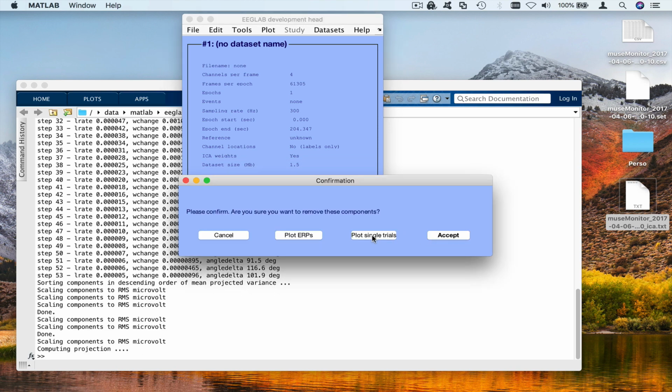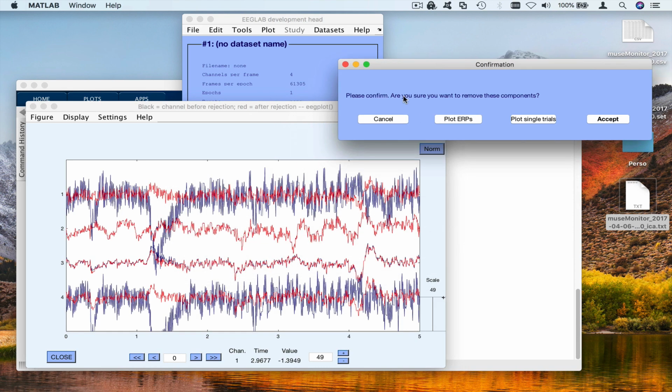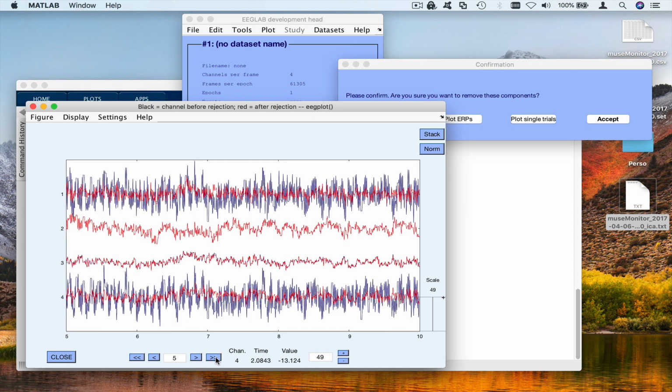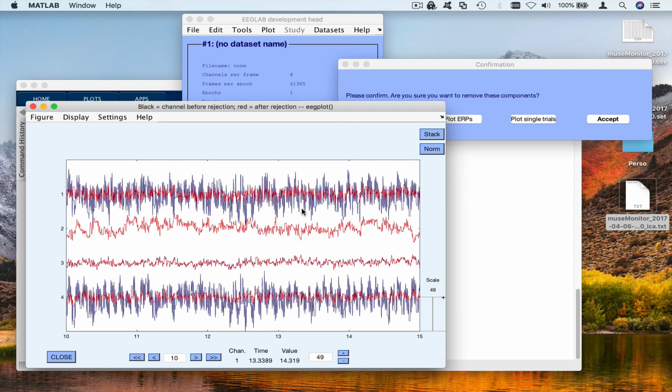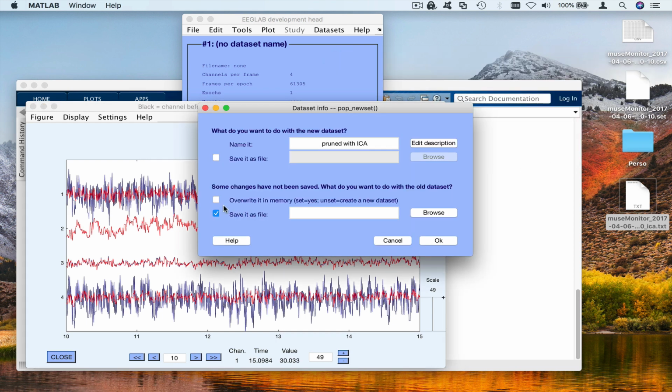We can plot the single trials before and after. So we see that this channel two is barely affected, this channel three barely affected, but we see channel one and four are very strongly affected. It removes a lot of the noise in this channel. So we're going to accept and override the parent.